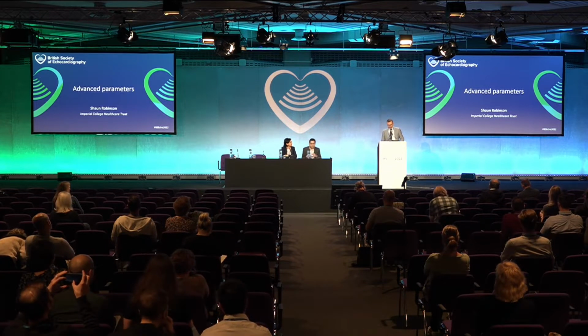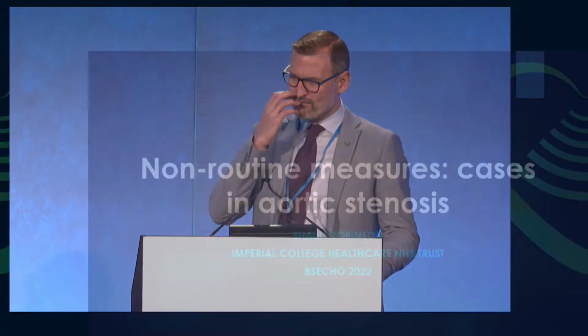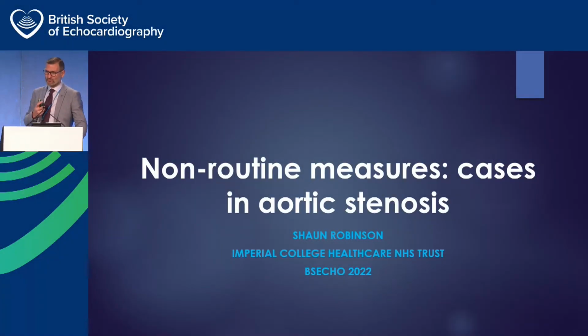Thank you very much. So I've changed the title of my talk slightly from advanced parameters to non-routine measures, because that's exactly what they are. They're measures that we don't apply routinely. We shouldn't consider them as a next level up from our standard method of assessment. They've got very specific application for consideration, but they are non-routine measures.